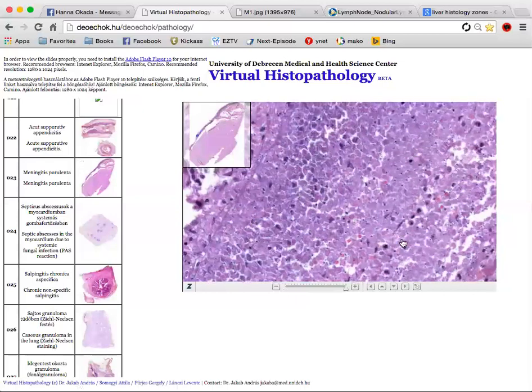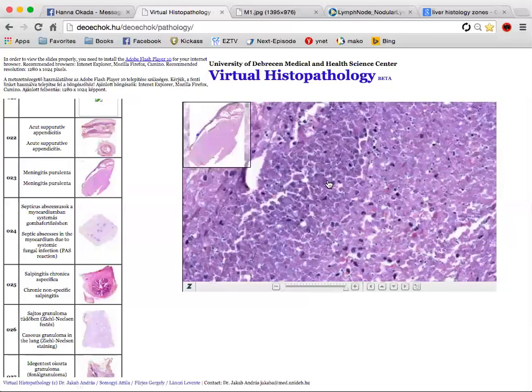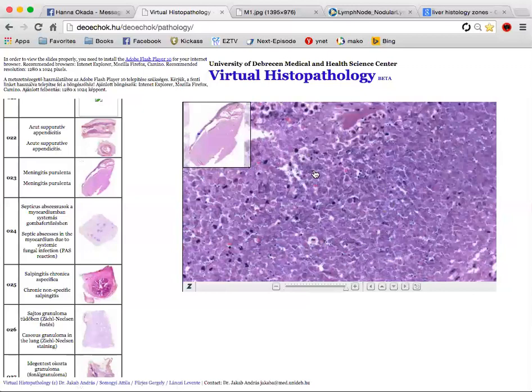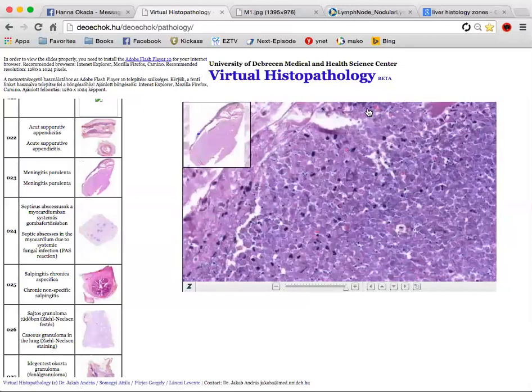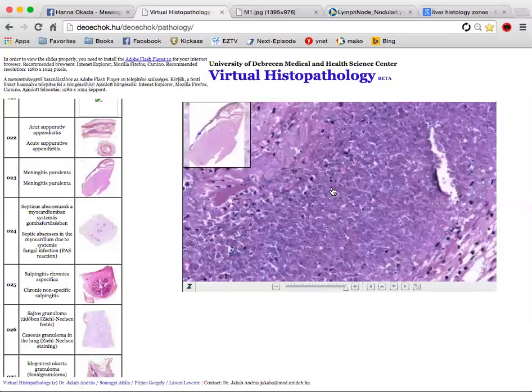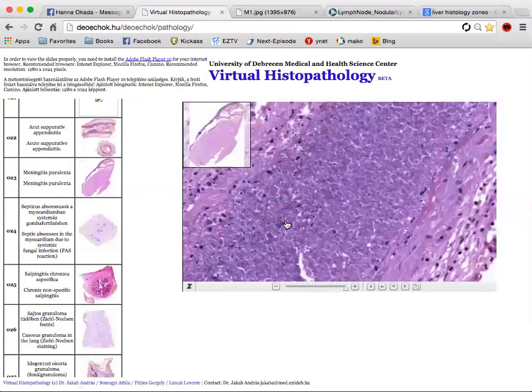So it has bacteria and immune cells and tissue debris. And this is all found where the cerebrospinal fluid would normally be. I can also see some blood cells here, so there's some hemorrhage. So this is all pus, and this is usually because of bacterial infection.